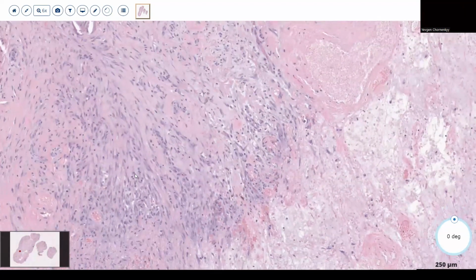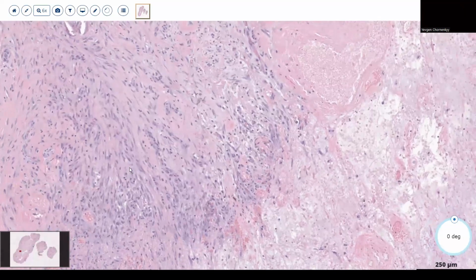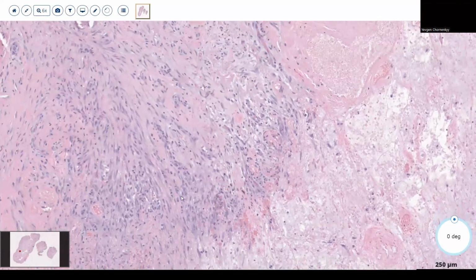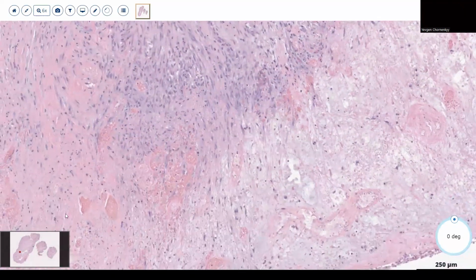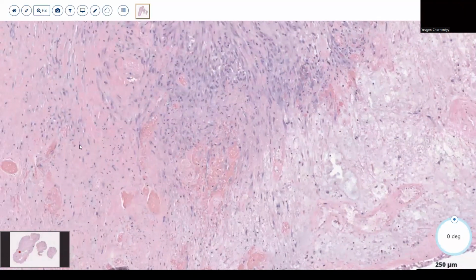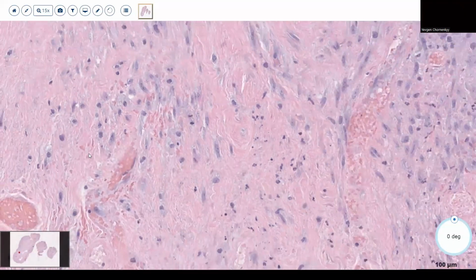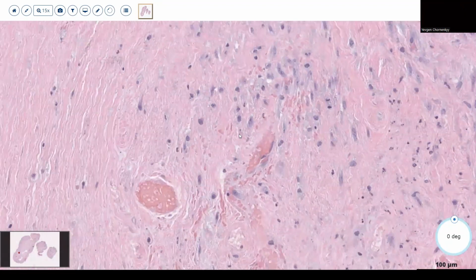Not sure from here, but is that desmoplastic changes? I kind of see the stroma, yeah, myxoid changes. That's a really good thought. So we got possibly some desmoplastic changes. But look at all these cells. Let's go high power. Have you seen any variation in size and shape?